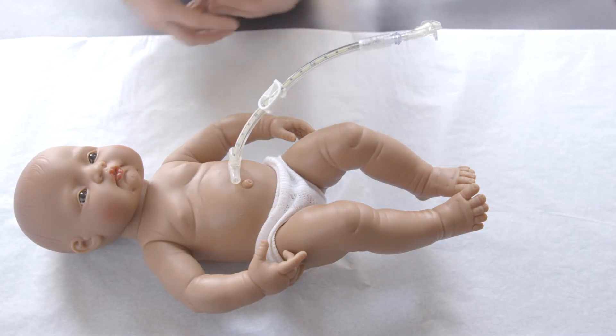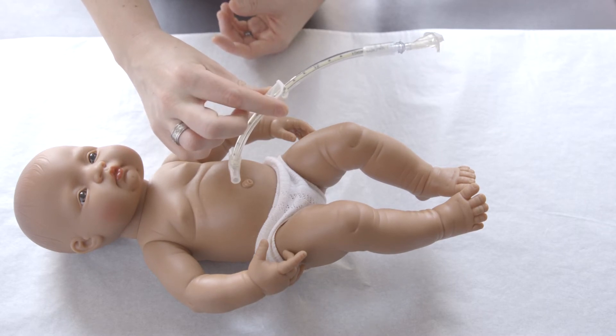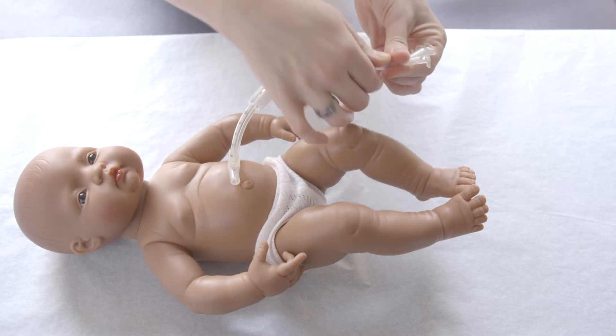Step 1: Clamp the tube to prevent stomach contents from spilling out. Step 2: Untwist the skirt from the Y-Adapter and slide it down the tube.